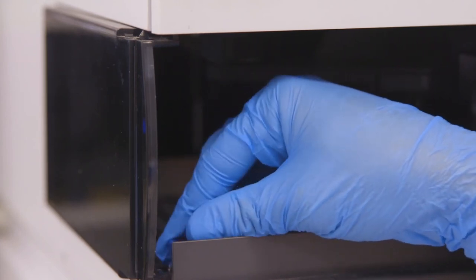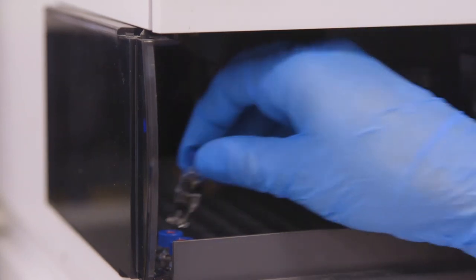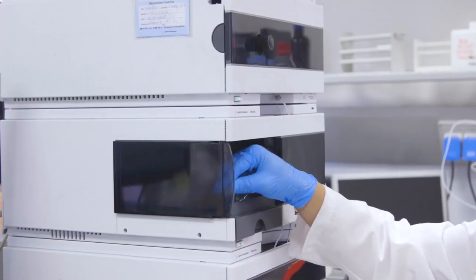Following this we place the vials in the autosampler tray starting from the calibrator, continuing with the controls and samples, and starting the sequence. The chromatographic run time is five minutes and for our sequence of seven samples all results will be obtained after 50 minutes of instrument work including the injections of the calibrator and the two controls.